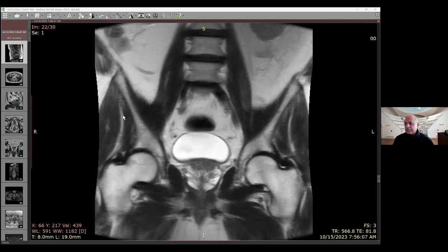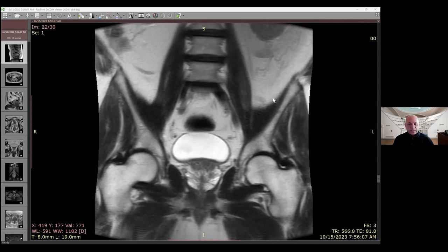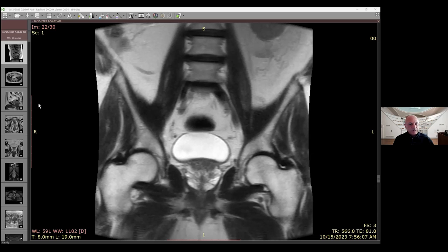We start with our first case. This is a 63-year-old gentleman. His PSA is 7.8 and his PSA density is 0.18, so clearly it's more than 0.15. The urologist felt something on the right side and sent the patient for an MRI before biopsy to see if we find something they can target.